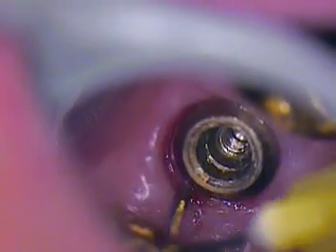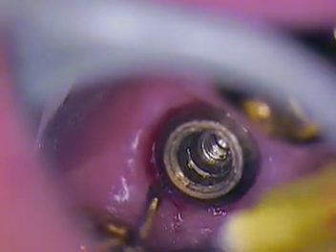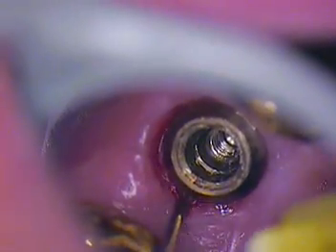Sometimes, John, a few of the little particles might come up from around the implant. And that's the artificial bone that was placed around that site. So if you had to graft it a little bit, you might see that. So I'm just suctioning right now. All set with that? Okay.